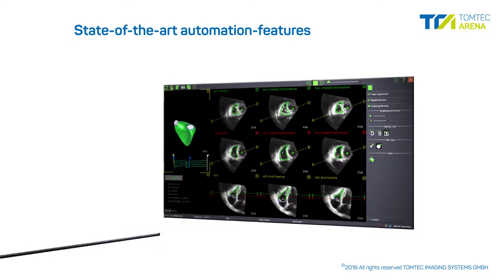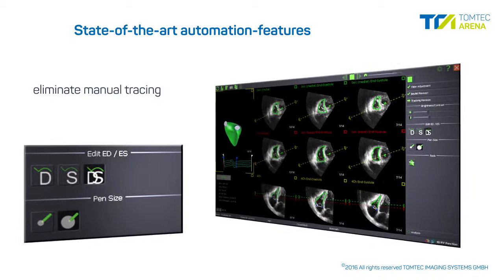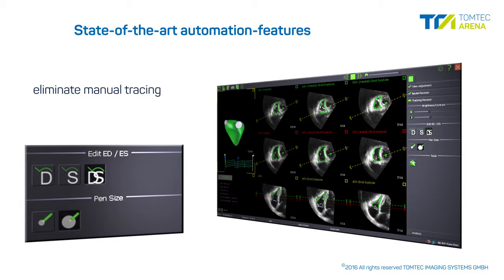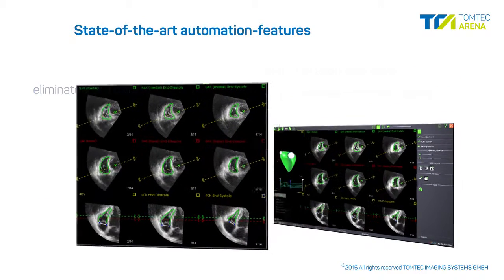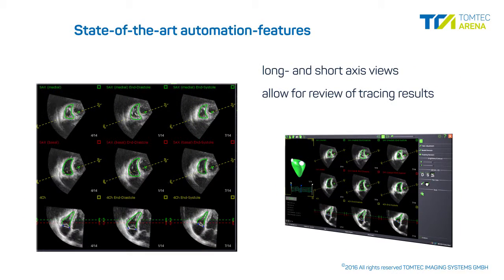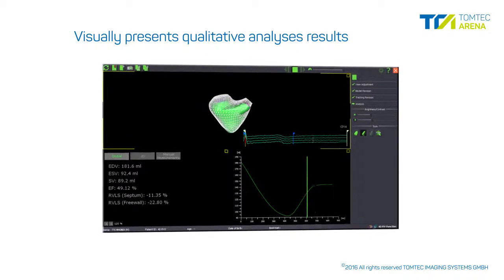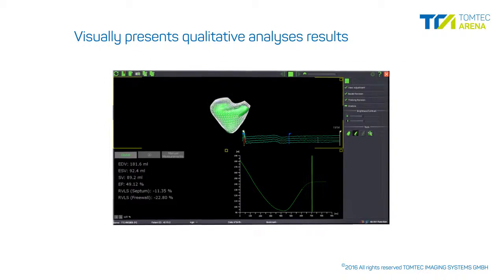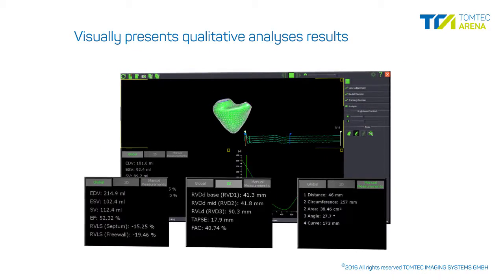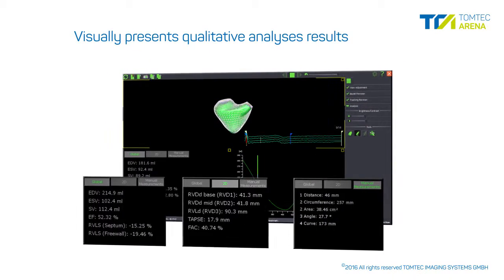State-of-the-art automation features eliminate the need for manual contour tracing and yet leave the clinical expert in control. Automatically traced endocardial contours are presented in long and short axis views and allow for a comprehensive review of tracking results. 4D RV Function visually presents qualitative analysis results next to a comprehensive set of automatically derived measurements.